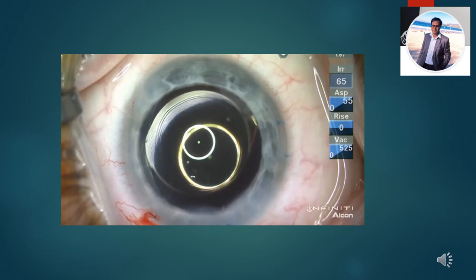What you can see is also the fourth reflex that is coming from the posterior part of the lens, sorry. And that's always inverted. By seeing that inverted image of that reflex, you can understand that that is the fourth Purkinje's reflex, that is from the posterior IOL. And what you need to do is basically align those two lights, and see that those two lights go through the center of the pupil, the center of the bullseye.